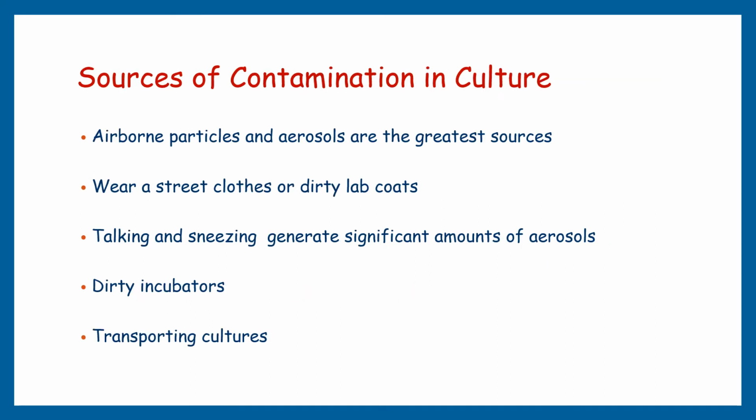Airborne particles and aerosols are the greatest sources of microbial contamination in most laboratories. The major source of particulates and aerosols is laboratory personnel.